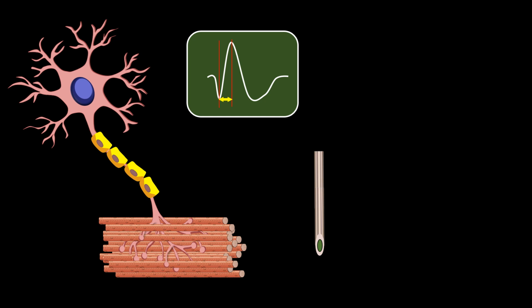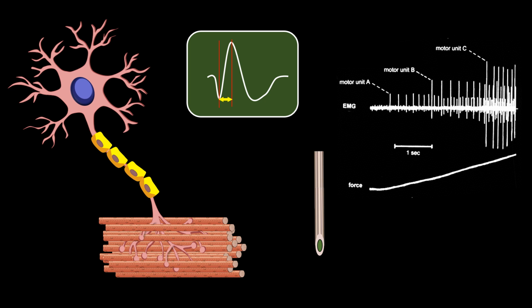It is at this time that motor unit potential parameters are assessed, and the contribution of the different muscle fibers to these parameters was investigated by different authors. Those authors investigating motor unit potentials brought about by minimal muscle contraction, as illustrated here, found that only some of the muscle fibers of an activated motor unit contribute to the potential being recorded. In this frame, I have encircled the fibers contributing to that potential.